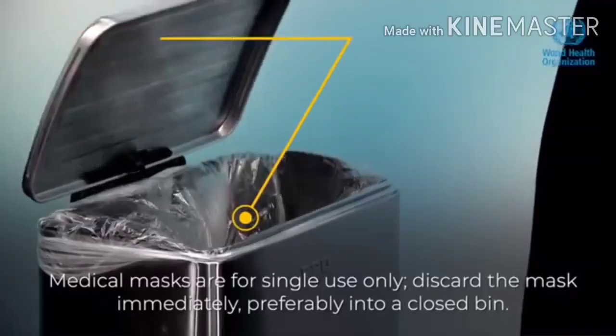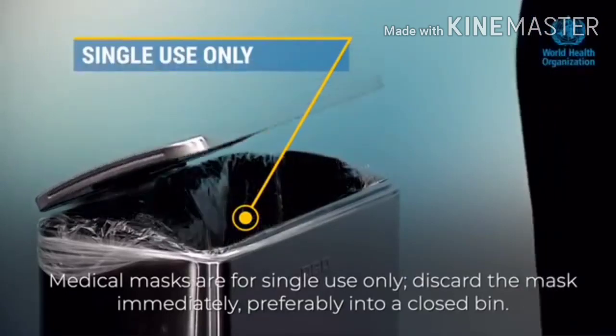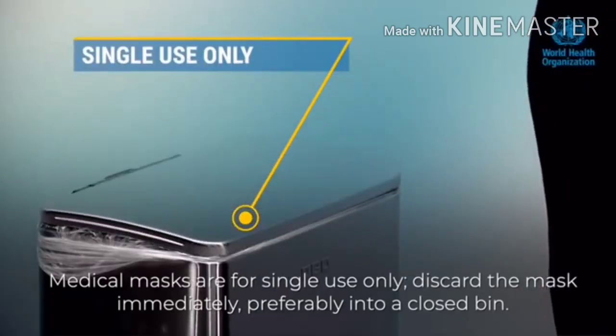Medical masks are for single use only. Discard the mask immediately, preferably into a closed bin.